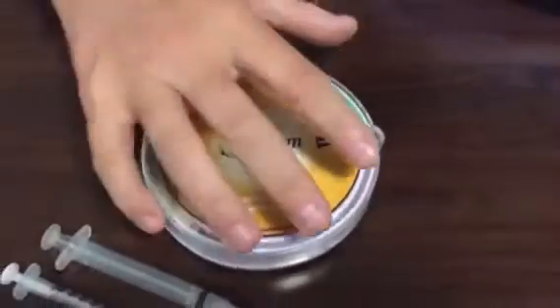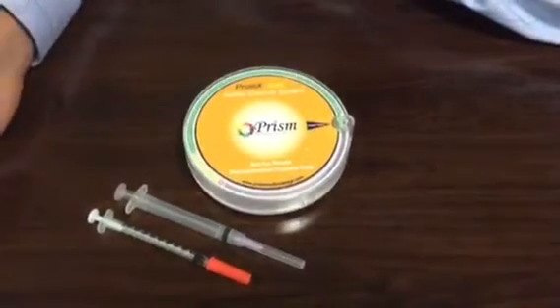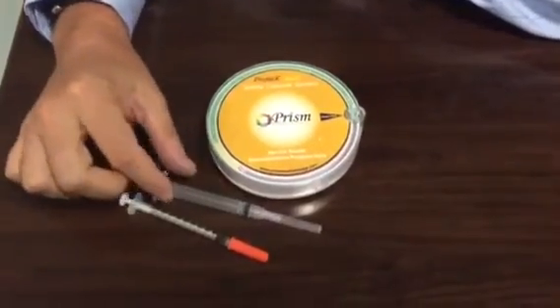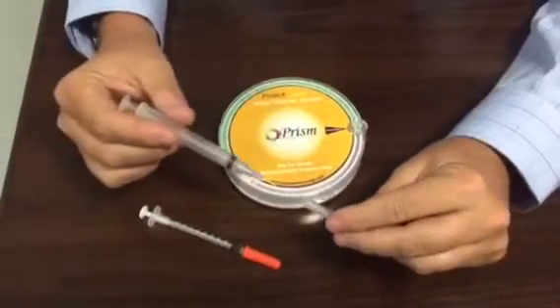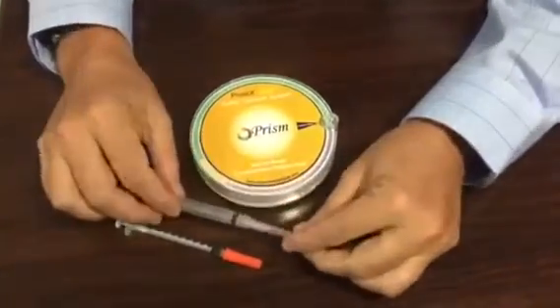Once you use that last one, you simply remove the system and put another one in place. To demonstrate the safety system I've got two syringes here — a 27 gauge needle that represents most of the needles used in dentistry today.